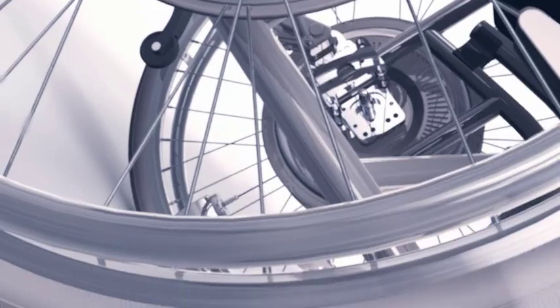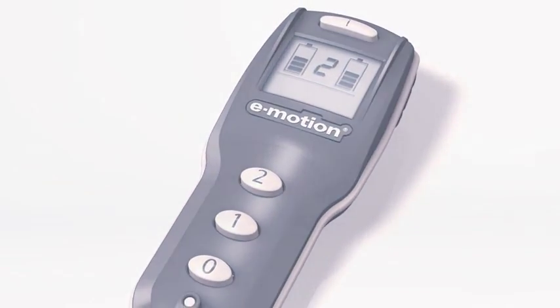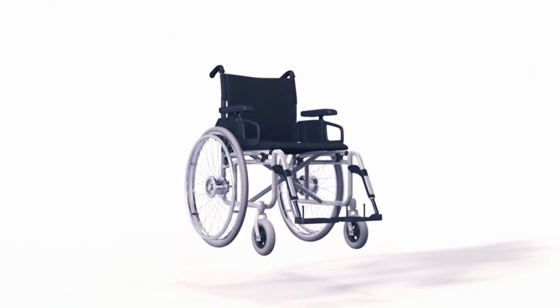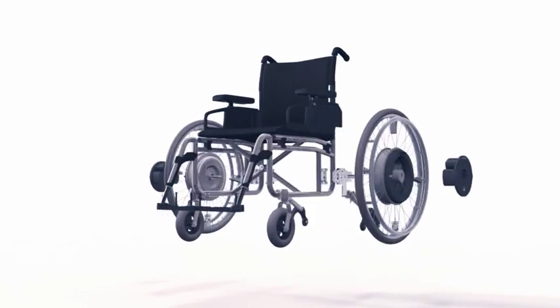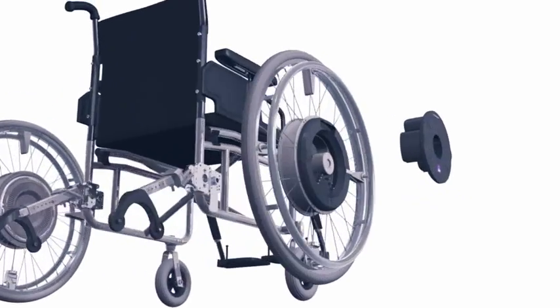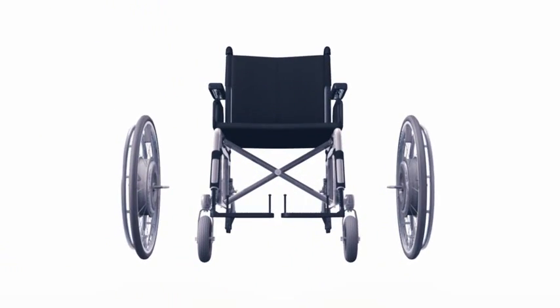E-Motion. Power at your hands. Power assist for wheelchairs. Electric motors integrated in the wheel hubs give your wheelchair an extra portion of power for climbing slopes and overcoming long distances with no trouble at all.